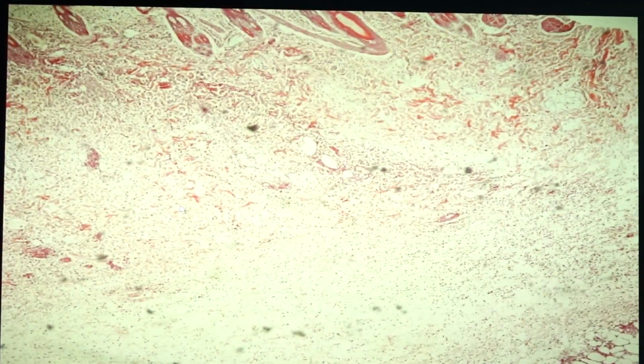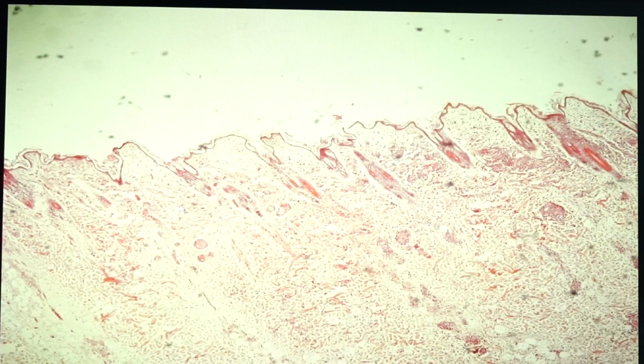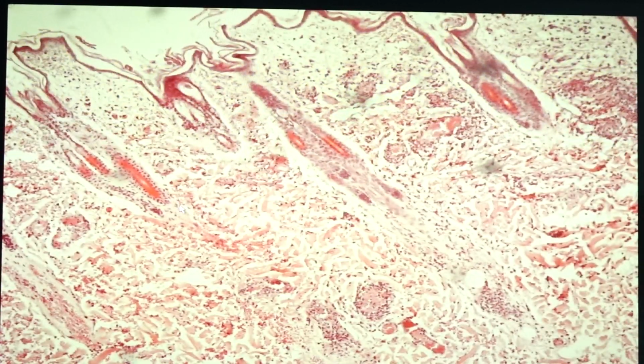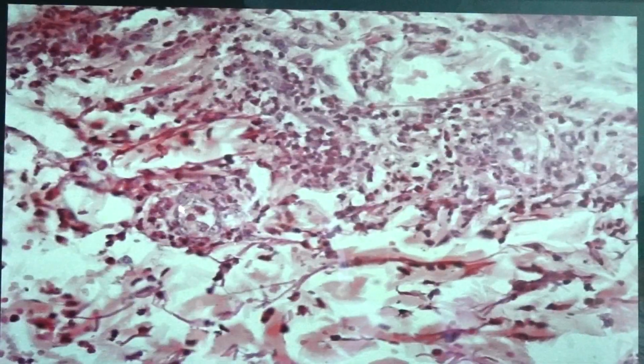Okay, now let's go to the next slide, which is slide 16. This is called necrotizing vasculitis. So this is a skin slide, okay, wherein we would see the presence of some inflammatory cells. These are segmenters.